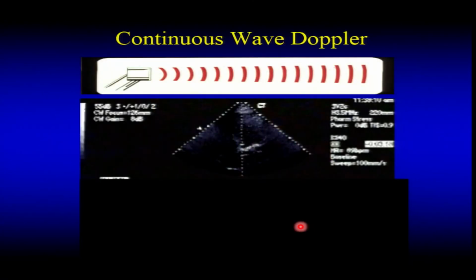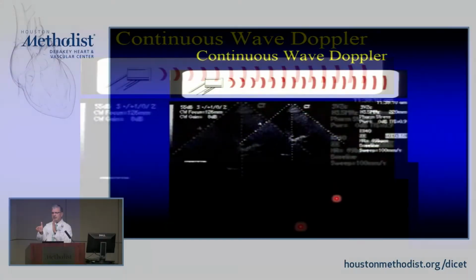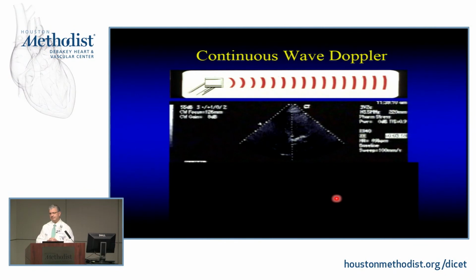I'm going to skip high PRF, and we can talk about continuous wave Doppler. In continuous wave Doppler, I'm sending whatever frequency continuously and listening continuously along the same line. I'm going to pick up anything on the way, anything on the road in that line.